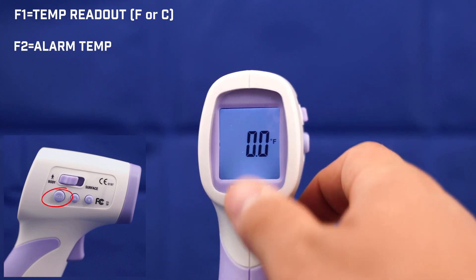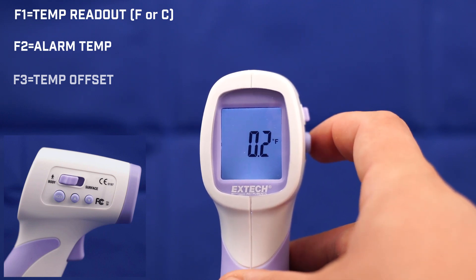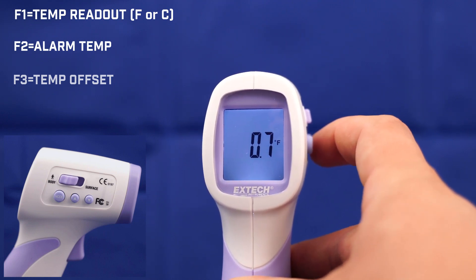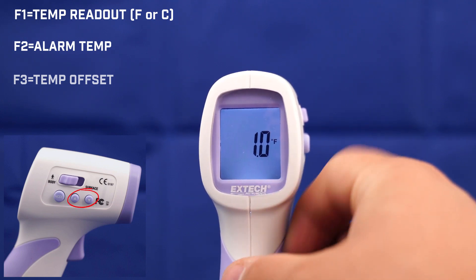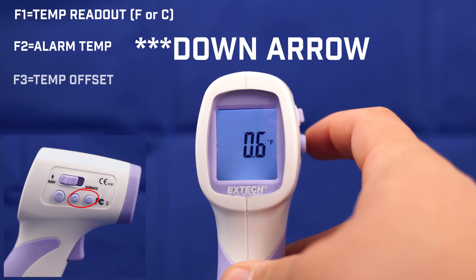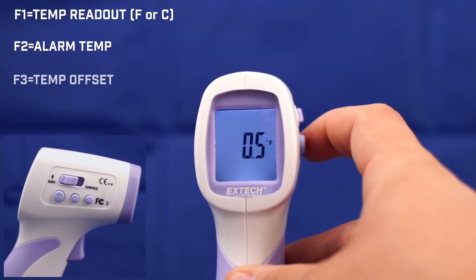The next one is F3, and this is where we adjust our offset. In this case, I had a one degree positive delta, so I'm going to set a positive one. If it was negative, you hit the minus sign and it will go negative as well. So I'm going to keep it at one.